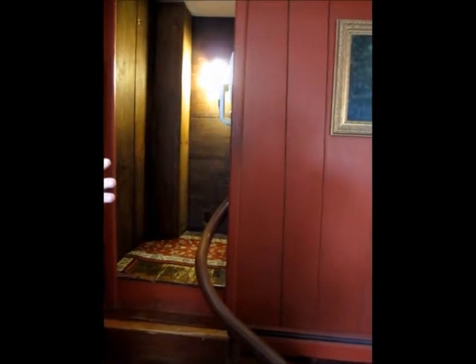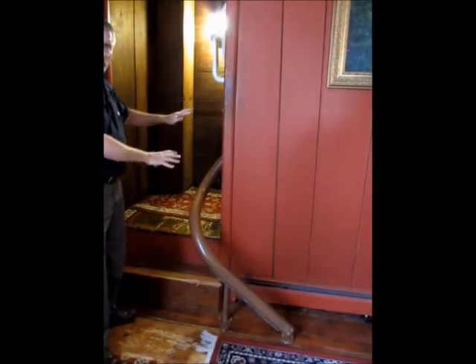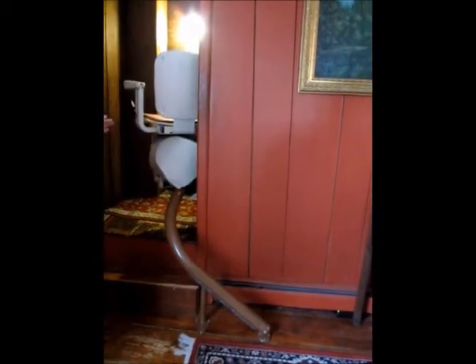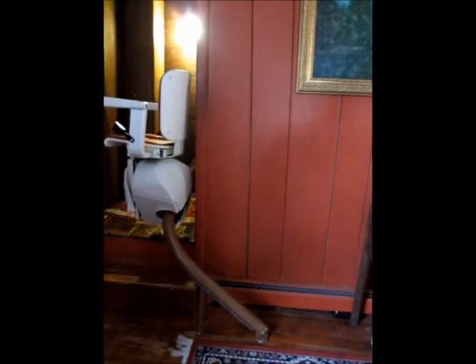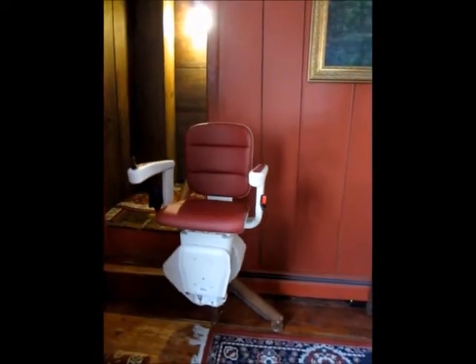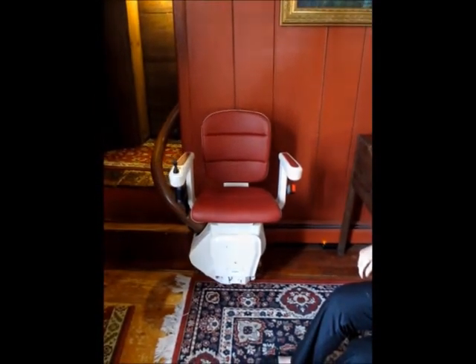In this case, we've installed the lift in a 17th century home. As the lift travels back down, you see it go around this curve. It's traveling on a single monorail, so it takes up very little space. The rail can be a variety of colors. It comes to the parked position at the bottom, so it's easy for the person to get on and off.